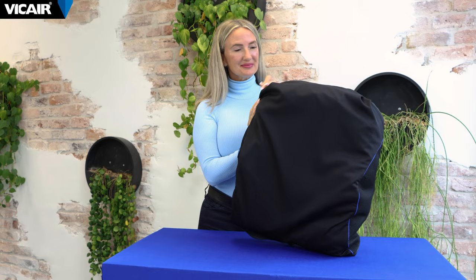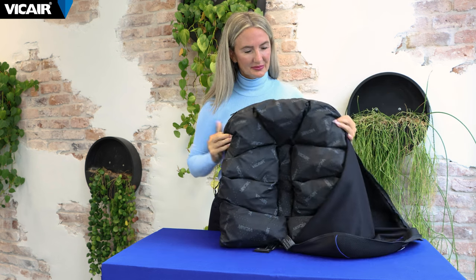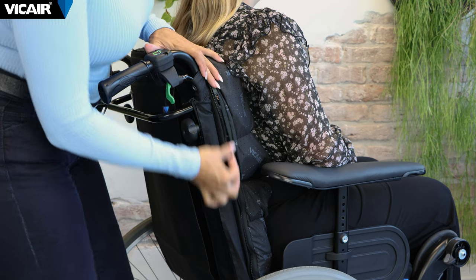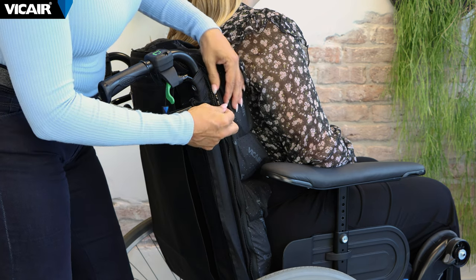The back cushion is developed to support an upright position by creating extra support at the lumbar thoracical extension of the spine. It also automatically adapts to the body's contours. It can be adjusted to accommodate optimal positioning and/or pressure management, all while the user is seated and leaning against the back cushion.